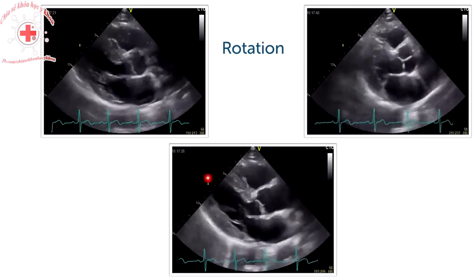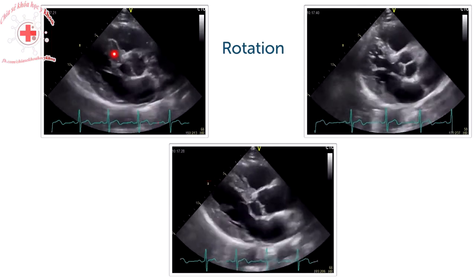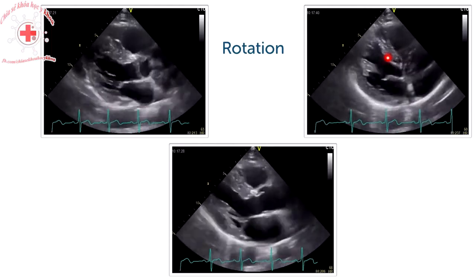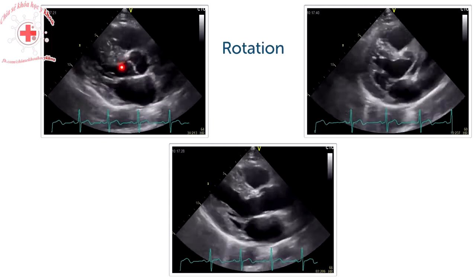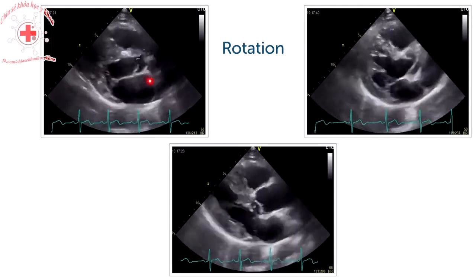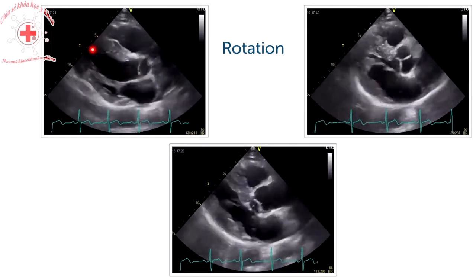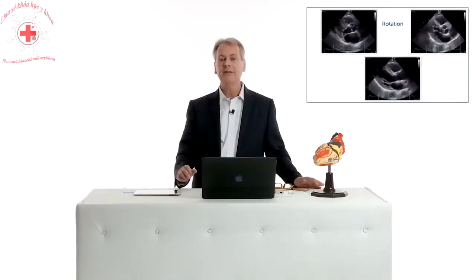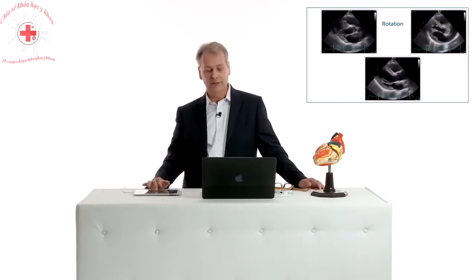Actually, you don't see myocardium here in this region. If you either rotate counterclockwise or clockwise, you'll have a different view. You will not see the entire ascending aorta. The aortic valve or the aortic root will look almost round, and you will have myocardium right here. So if you have these views, you just need to rotate either clockwise or counterclockwise to get to the correct view.